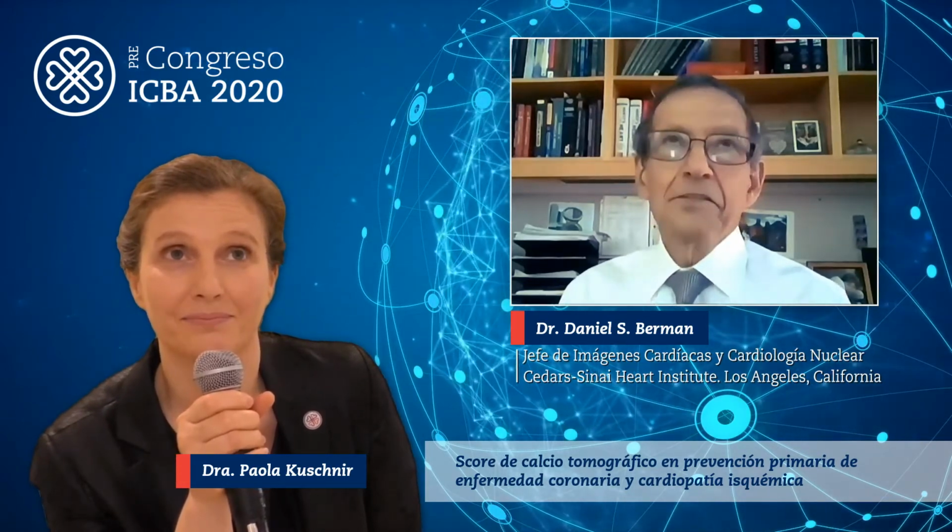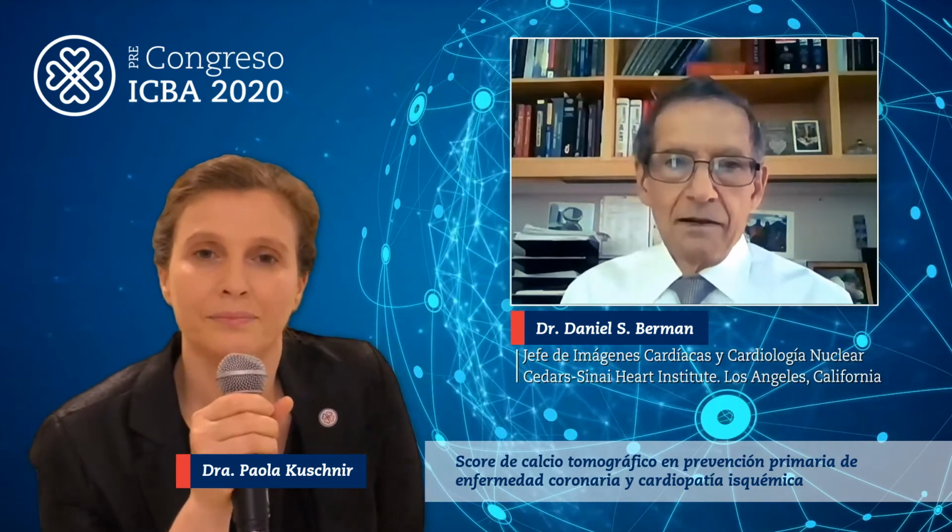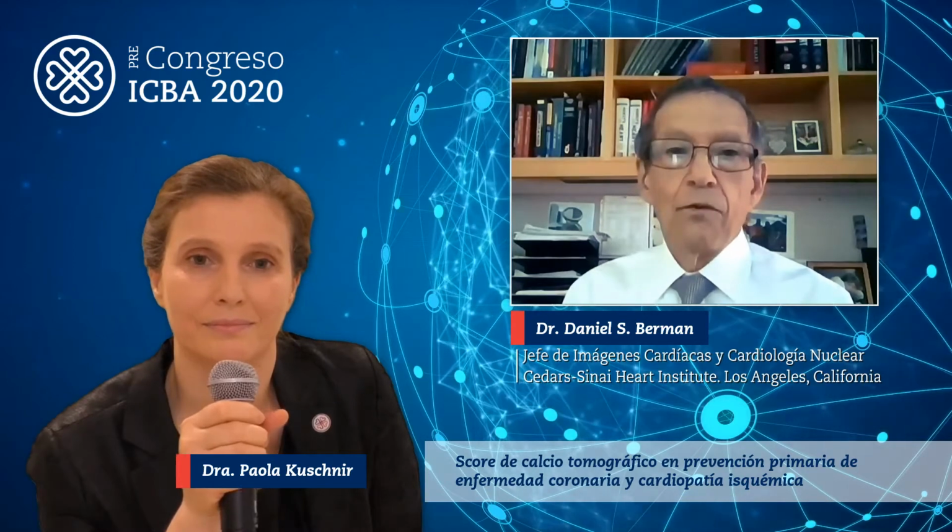Well, I think first we should just talk about what it measures. The calcium scan really reflects the impact of all of the risk factors for coronary heart disease or for atherosclerotic disease that are acting in an individual patient over a lifetime.